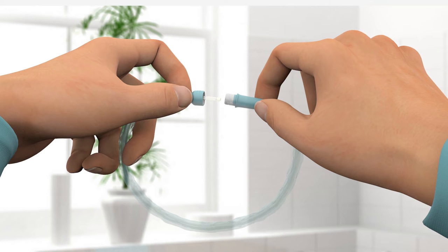If you use a urine bag, you can simply connect the catheter to the urine bag to drain it.